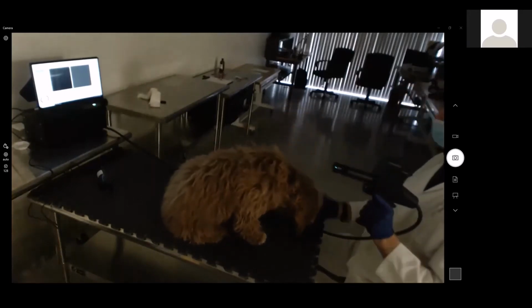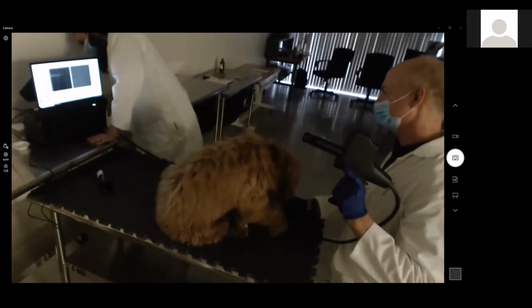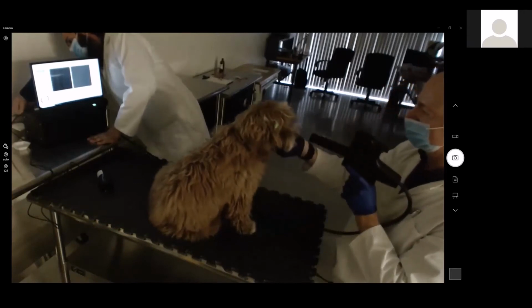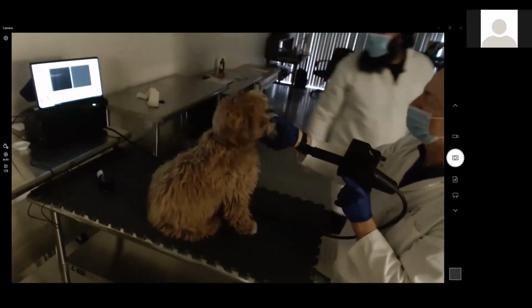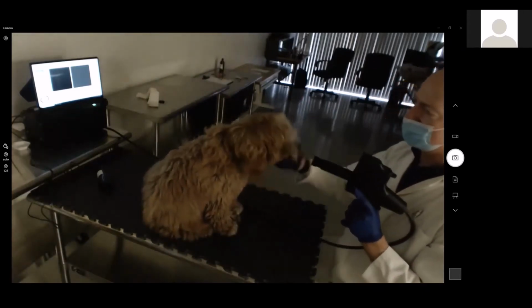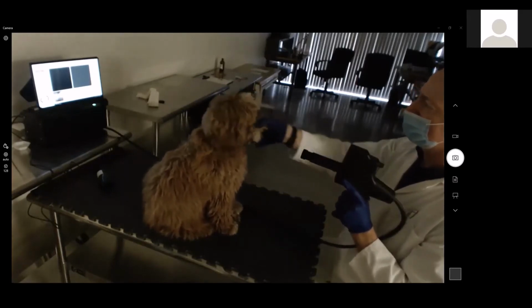I don't have a foot switch. One second. All right, we should have one. Okay, we'll just do the key strokes from the place. All right, we're just going to skip. Go back to the mouse.